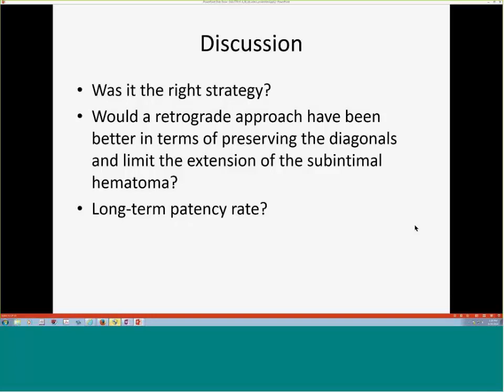I had one case yesterday where it was a very small vessel. I couldn't see it at all from the very beginning of the case. So in the end I ended up doing a STAR and balloon, and that one I ended up stenting, because I eventually got into it. But again, I try to avoid it as far as I can.